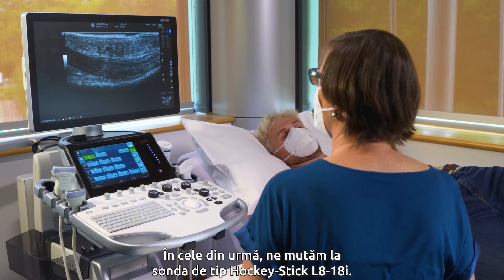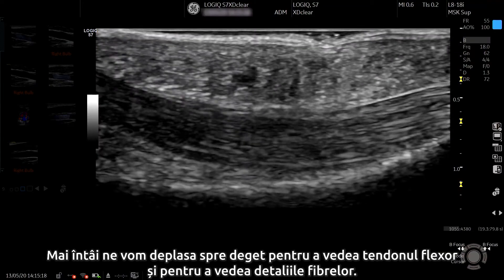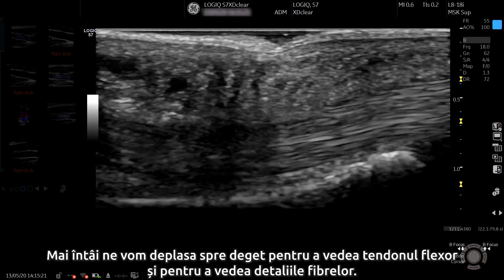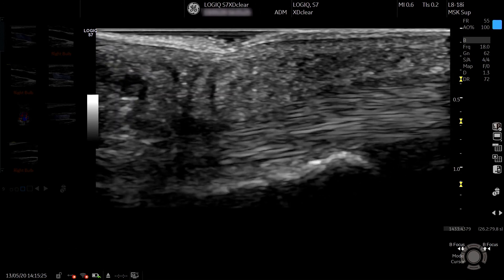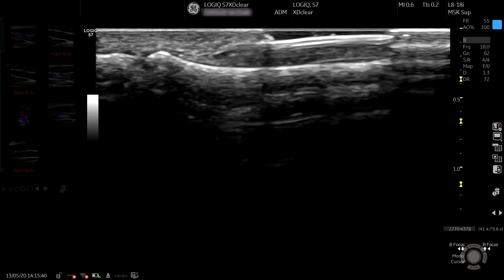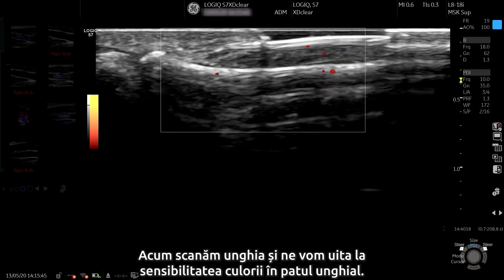Lastly we're moving to the hockey stick probe, the L8-18i. First we're going to move to the finger to see the flexor tendon and to see the detail of the fibres. And now we're scanning the nail and looking at the sensitivity of the colour in the nail bed.